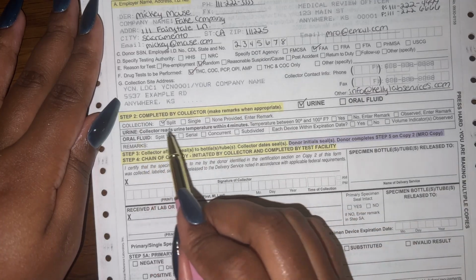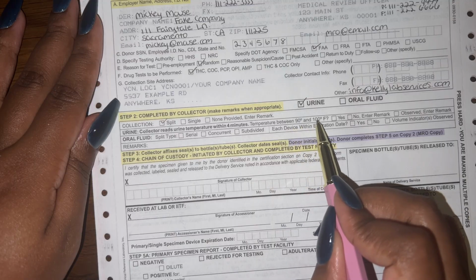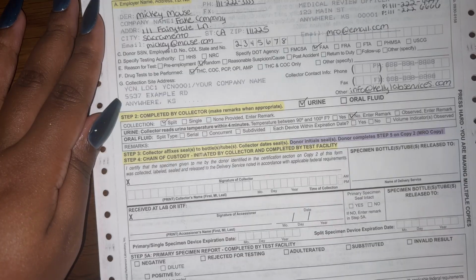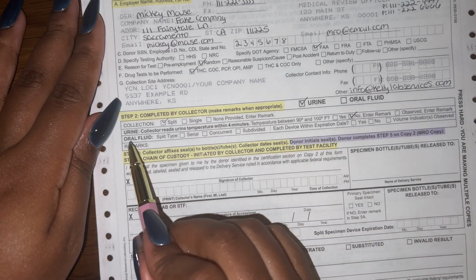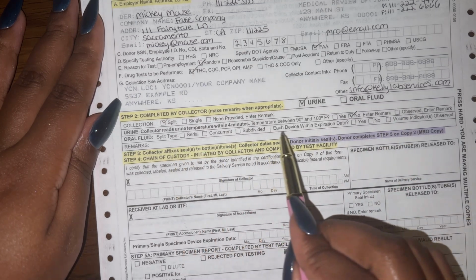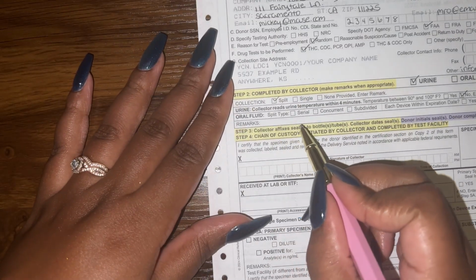Now, on the urine line where it's asking about whether the temperature was between 90 and 100 degrees or not, we're going to say no, because it was not between 90 and 100. Okay. This line here is for oral fluid screens. We are not doing oral fluid, we're doing urine. So we just skip all of these boxes here, and now we're going to write in our remarks.